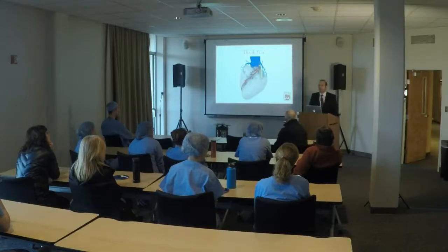That takes time, because you have to segment the epicardial coronaries, so it depends on the complexity of the atherosclerosis. But in the setting of a negative CT, I don't know, 10 to 15 minutes. It could go up if you have significant atherosclerotic burden.